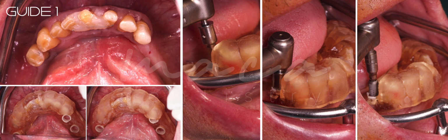So here you can see the first guide. This guide was placed before any extraction and previously planned, and used to place implants on the molar region and right premolar region.